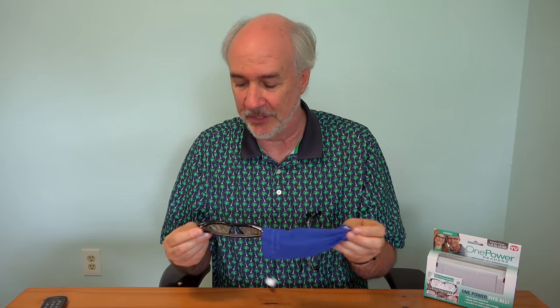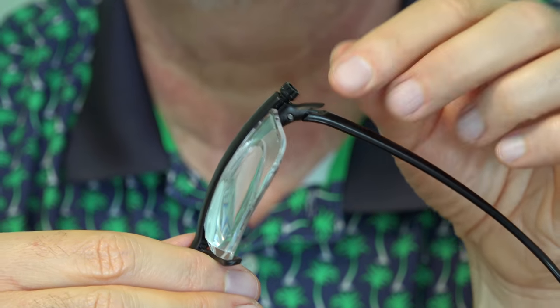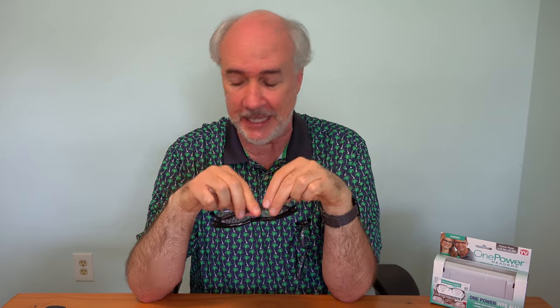The last pair of glasses I'll show you are the Dial-O-Vision, and you really do dial them. There's an actual knob connected to each lens, so each one you can independently dial and change the strength of the lens to suit your eyes. But this is for distance vision. I've never seen a pair of reading glasses that are adjustable where you can dial in the power — I'm not sure why they can't provide that. I kind of like that better because you can personalize it for each eye, and a number of people have the issue where one eye is a little bit stronger than the other.